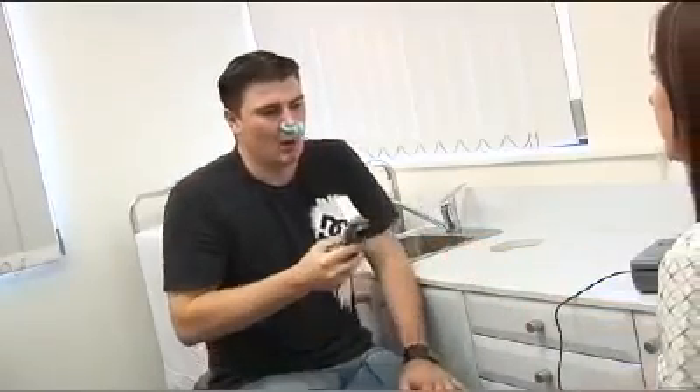Another very common problem is trying to blow into the mouthpiece like a trumpet, with your lips pursed and your teeth closed.